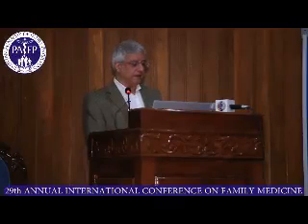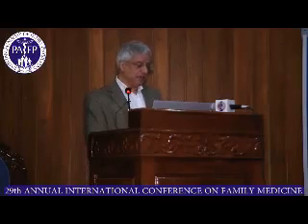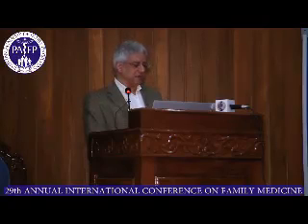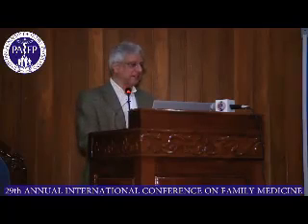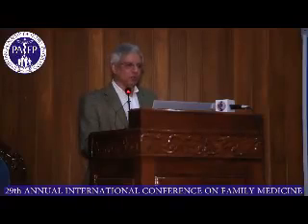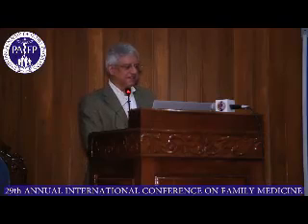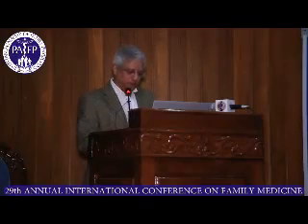But when you have yellow flags and red flags of uncertain headaches, you mostly follow them up and flag them till you actually require imaging. And you can see that imaging is basically based on acute changes within the behavior of the headache. So it's a complex thing. Headache is something which people do fellowships on for 2 years, still nothing can be done about it. So this is something which I'm trying to show off by telling you that we can characterize intracranial hemorrhages and strokes better than what we could do before.